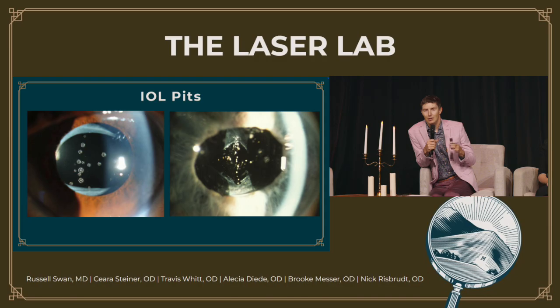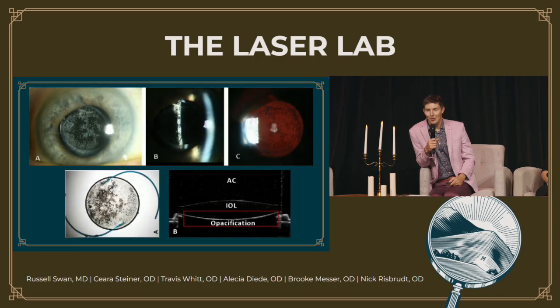If there's good news, actually, usually if you ever see a lens pit happen when you're doing a YAG, it's like, ooh, and it'll actually usually shrink in size with time. And interesting, a lot like asteroid, visually it is often not super significant for patients. So oftentimes, like this patient on the right in particular, or left in particular as you're looking at it, might not even visually notice those pits, even though you would think that they would. Similar to many of our patients who have asteroid hyalosis all throughout their vitreous, but the shadowing effect they get from a very small imperfection like that is usually not bothersome. Sometimes it can be, in which case we could talk about an IOL exchange, but that's not fun after someone's had a YAG.